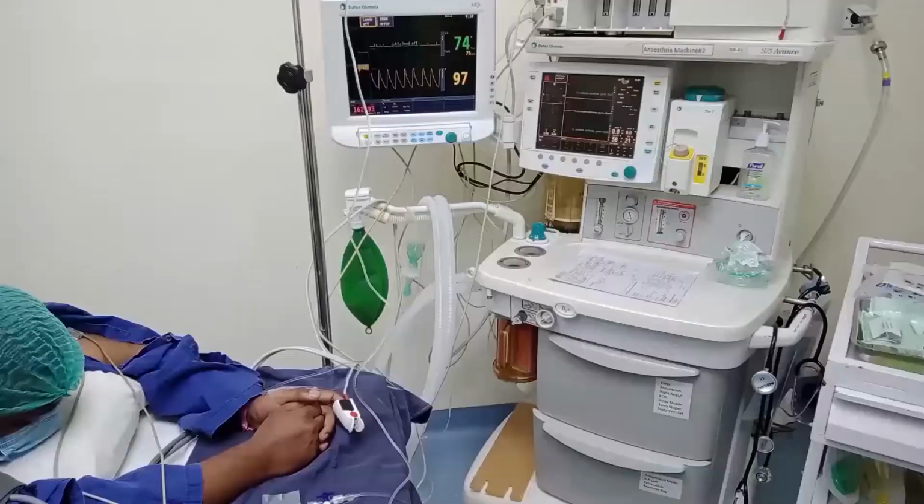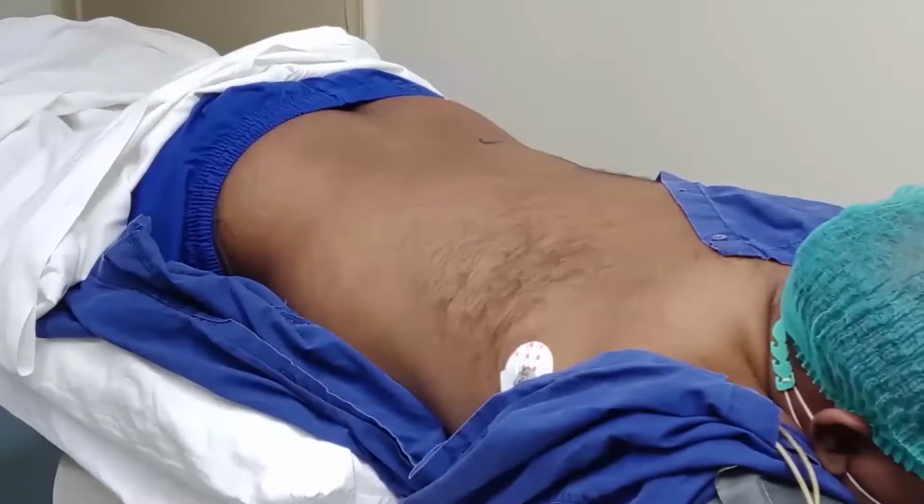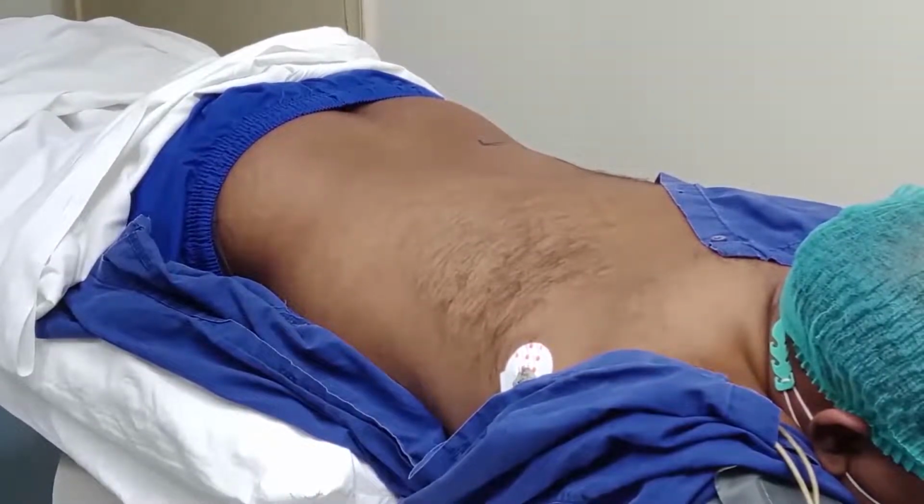For this procedure, we need standard monitoring: ECG, pulse oximeter, and non-invasive blood pressure. The patient should have IV access and attached IV fluid along with it. For this procedure, the patient is positioned prone with the help of two pillows. One is placed under the abdomen.